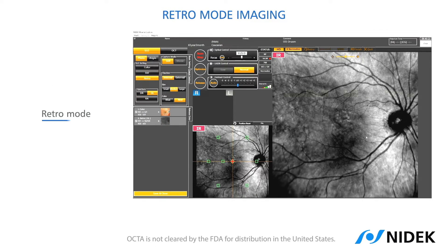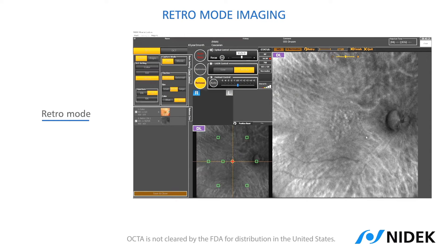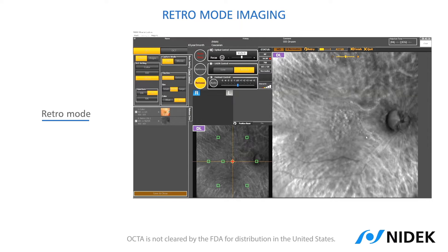In this very same way you can also capture retro mode images. Retro mode is a unique technology that captures the backscatter component of infrared light to create this innovative effect of retroillumination of the retina.